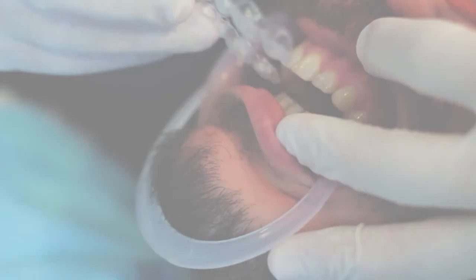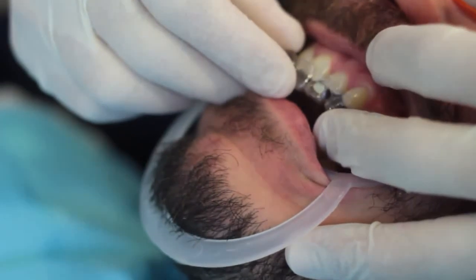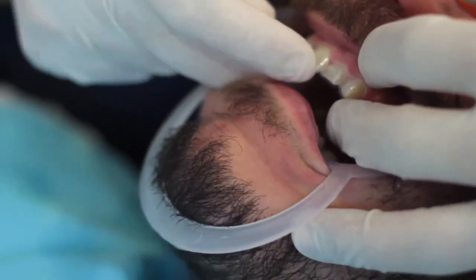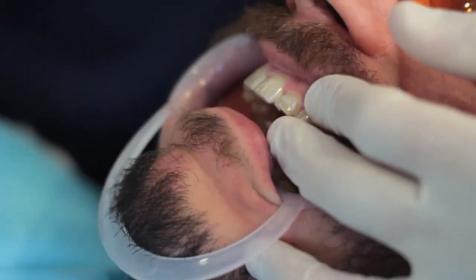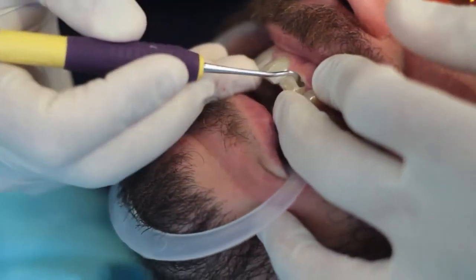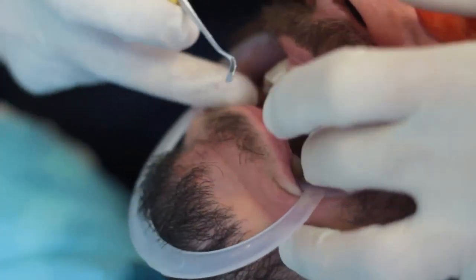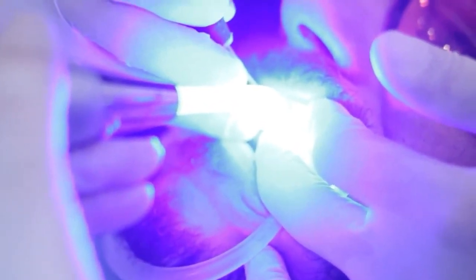Now, place the attachment template filled with composite material onto the patient's teeth. Ensure it fits well by applying gentle finger pressure or asking the patient to bite on a cotton roll. You can even use a dental instrument like a probe or tweezers to apply pressure and make sure each attachment is properly adapted to the tooth. Follow the manufacturer's instructions to light cure the composite material. To make things easier, start curing from the most posterior tooth, where moisture control is a bit more challenging.